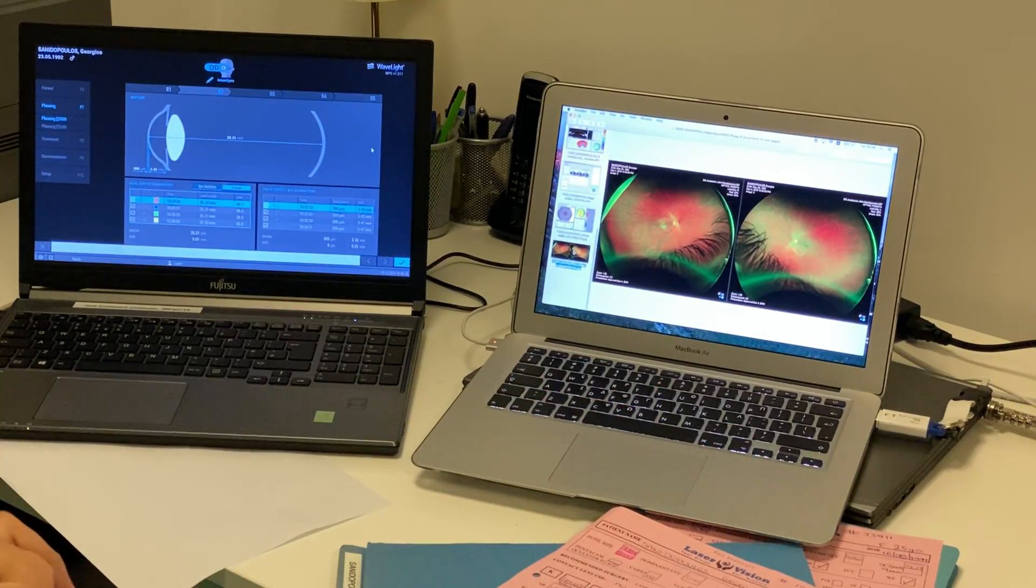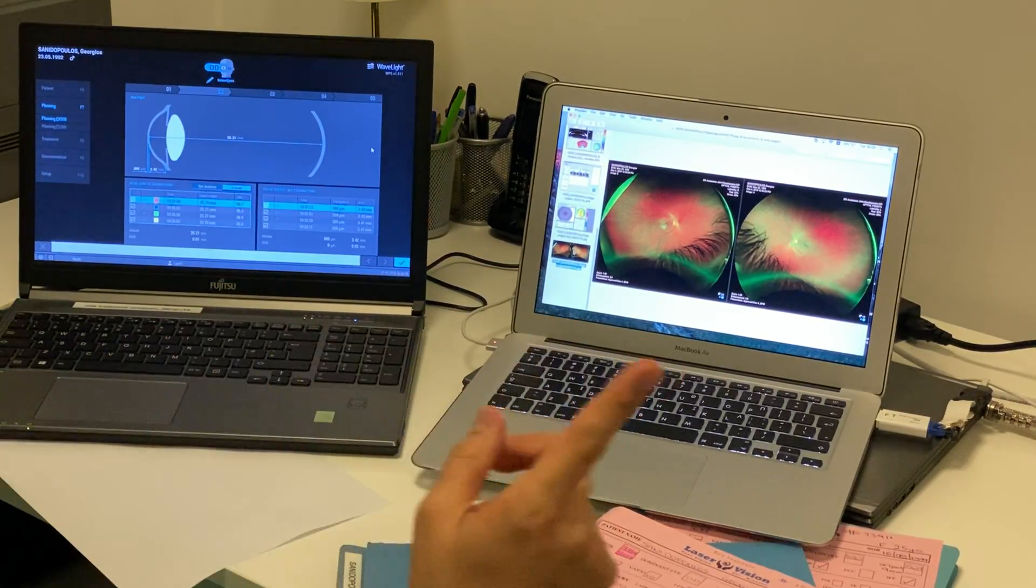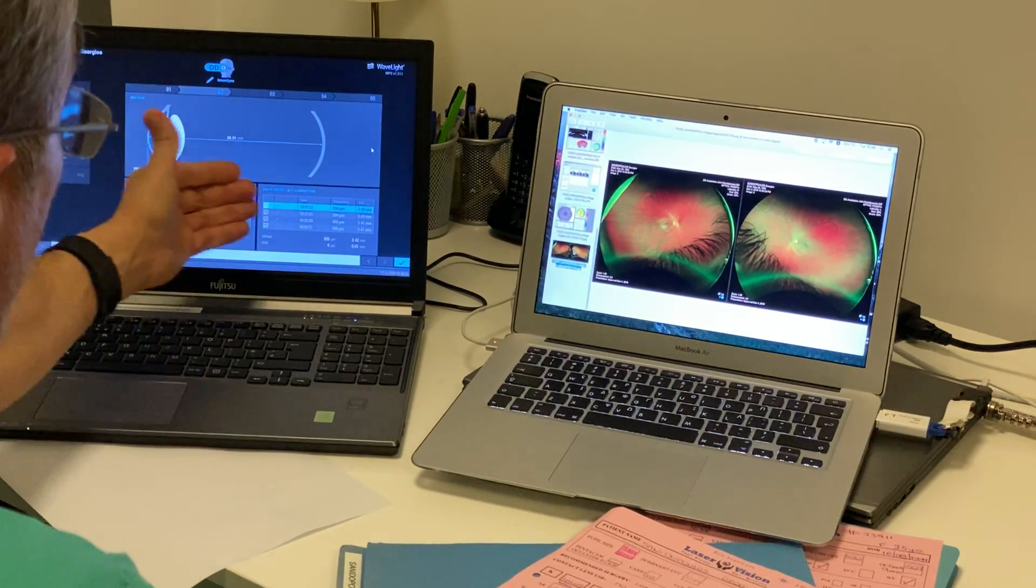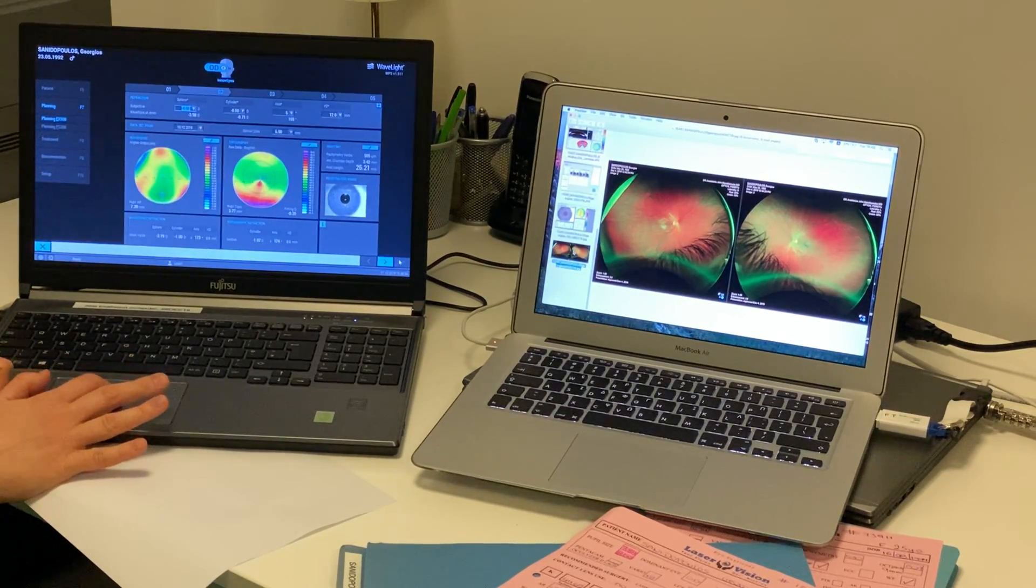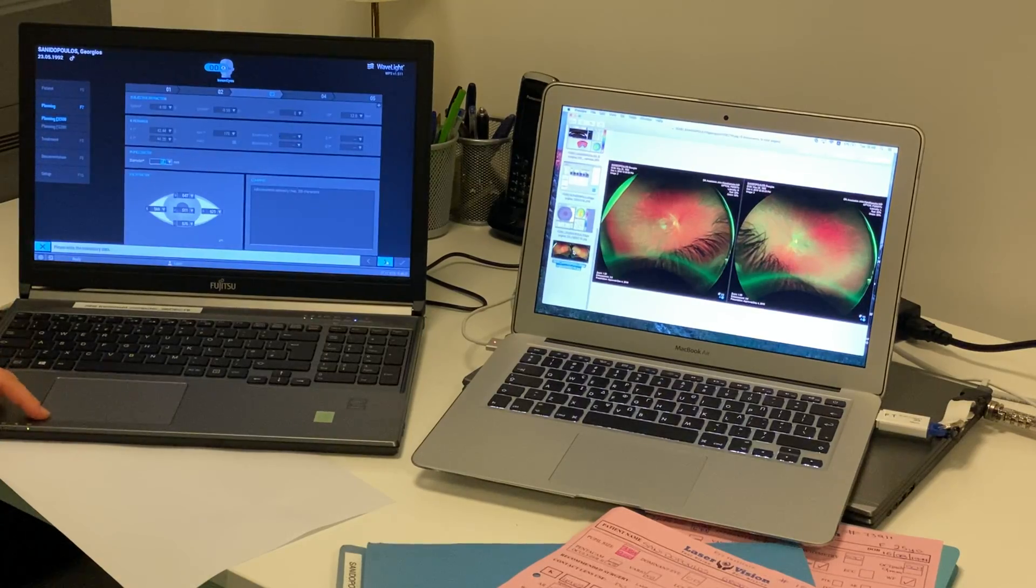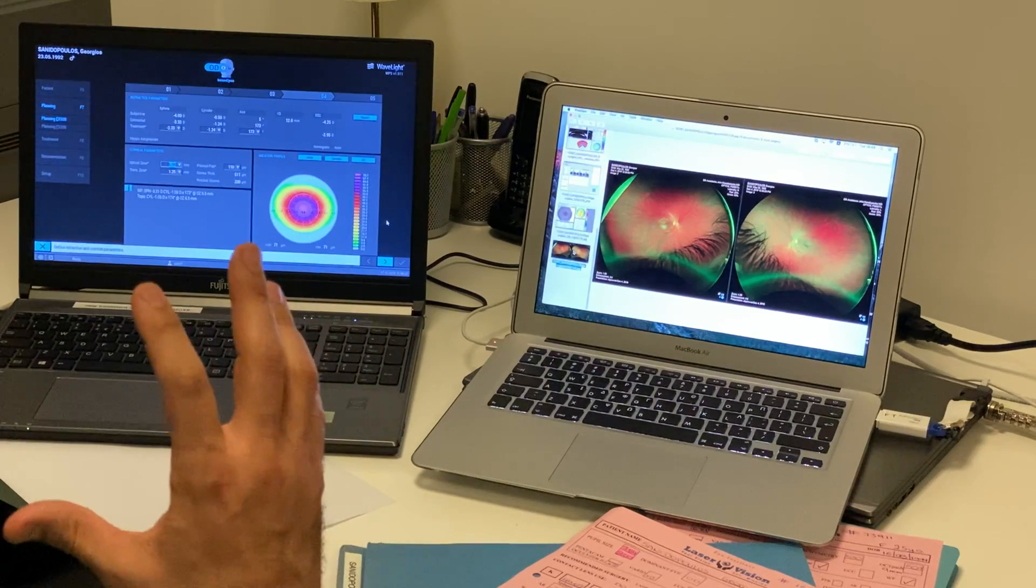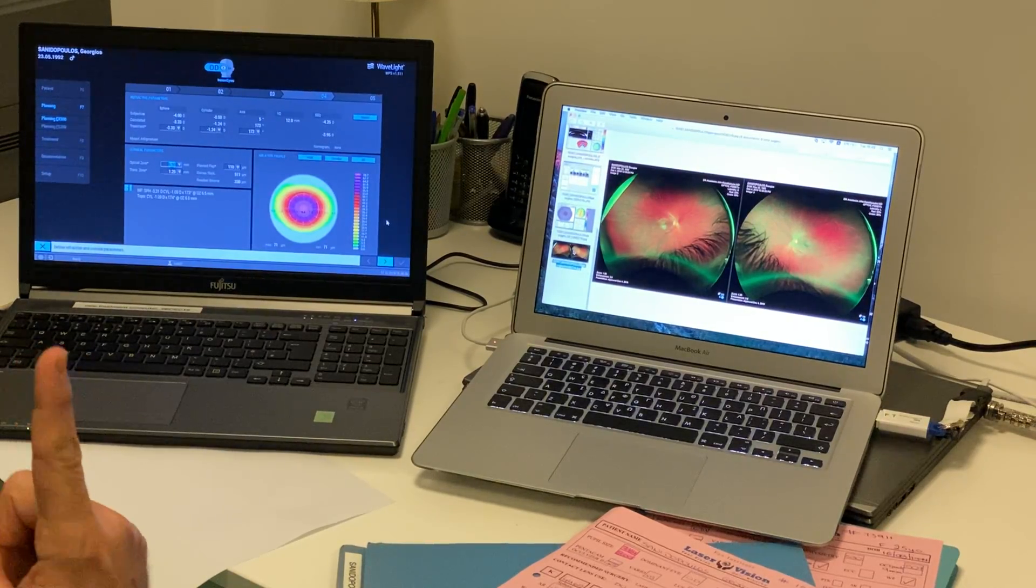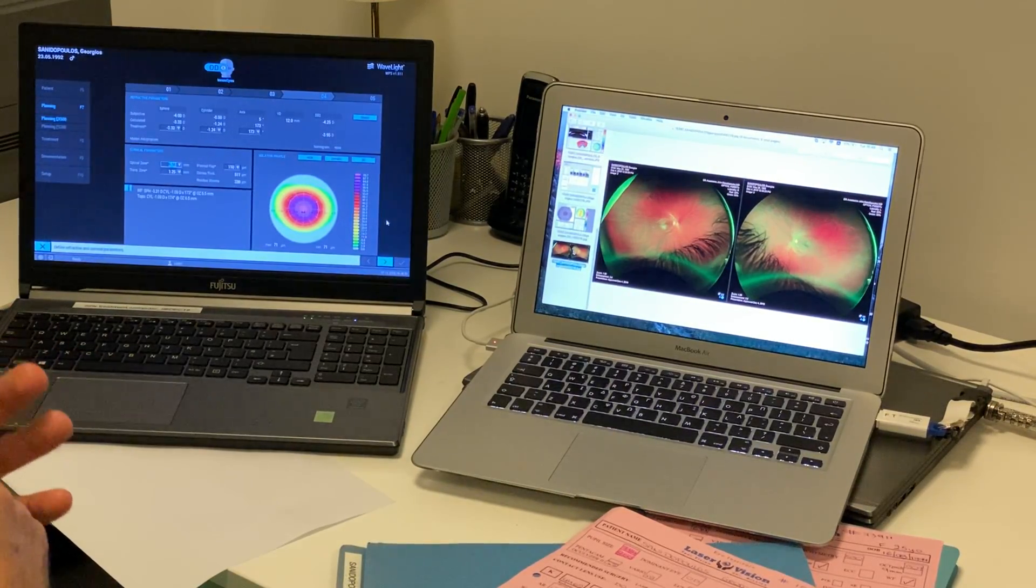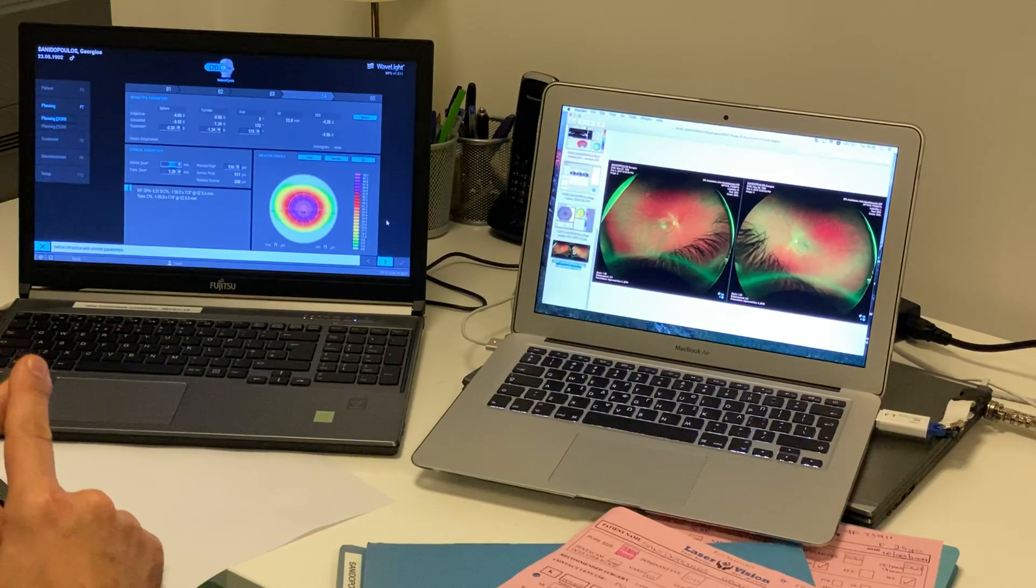We are at 0.04 hundredths, so four hundredths of a millimeter accuracy between the two interferometers. And again, here we'll select the consistency between the axial length measurements, we'll confirm that we accept the minimal diversity, and then we'll move on to the next step, where the device now is starting to calculate the refraction that should be treated. Now, in this refraction, six parameters are being taken into consideration. One we saw is the wavefront. The other one is the Scheimpflug Imaging Tomography. The third is the axial length.